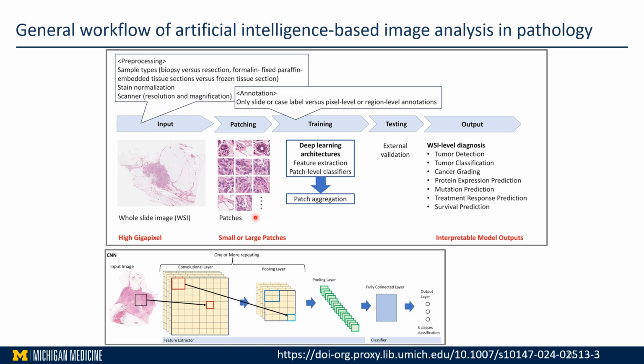Central to this process is the convolutional neural network, where convolutional layers apply specialized filters to the input, capturing hierarchical patterns through successive convolutional operations. To manage computation demands, pooling layers subsequently downsample the spatial dimension of the data, effectively reducing the complexity while retaining essential information.